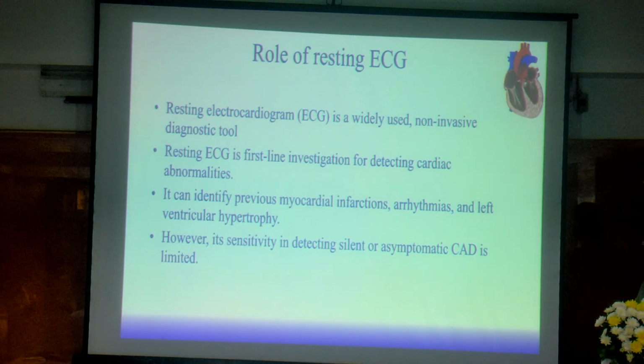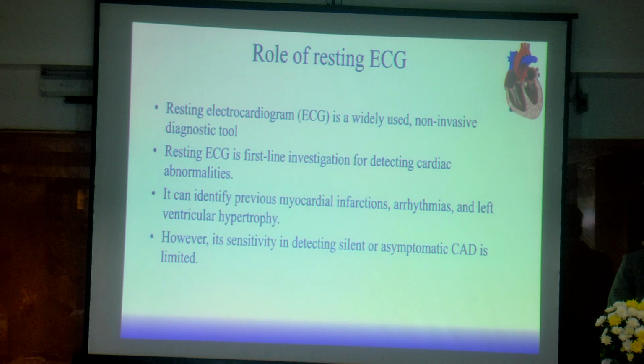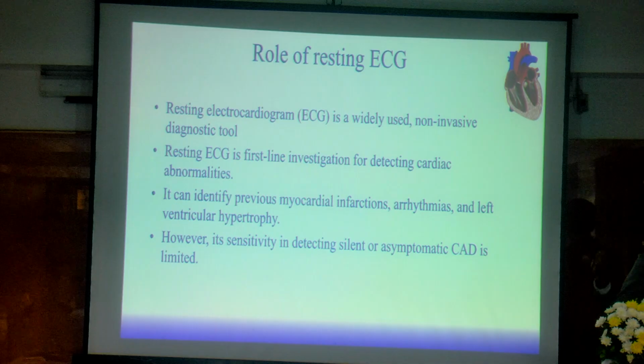So resting ECG is a very, very important tool. You know that, and it is very commonly used by all of us. It's very simple to take. It's a non-invasive modality, so it's a first line investigation. It can identify, like what I showed, a previous heart attack, silent heart attack, any arrhythmia, or even left ventricular hypertrophy associated with hypertension.